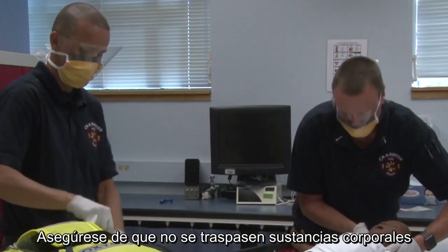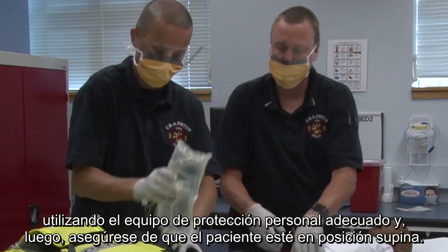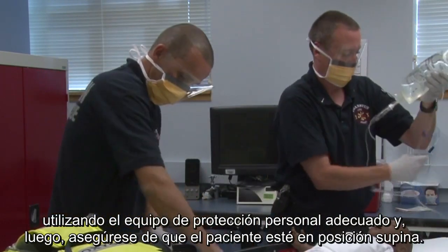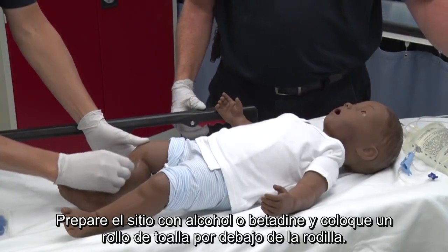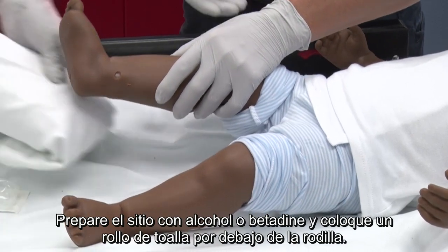Ensure proper body substance isolation by donning the proper level of personal protective equipment, and then make sure that the patient is in a supine position. Prepare site with alcohol or betadine. Place a towel roll under the knee.